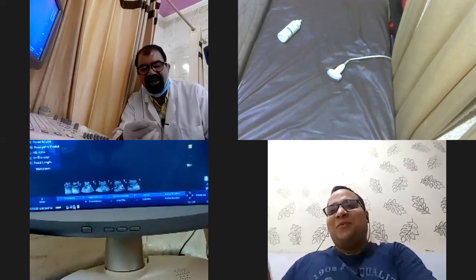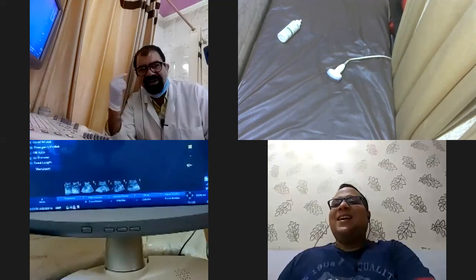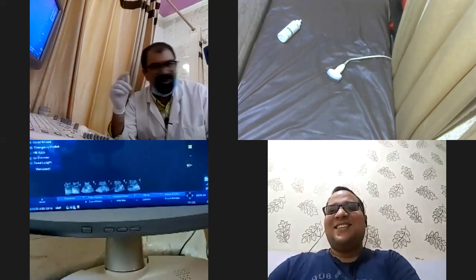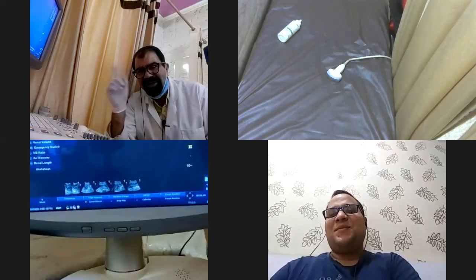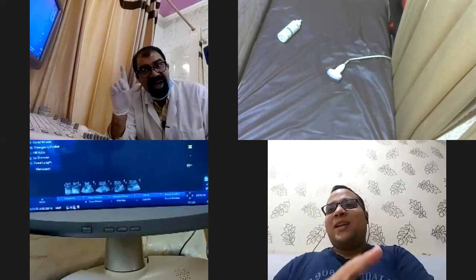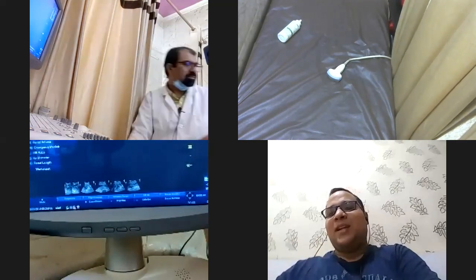Because in the video, you were about to pose me that question. Now, see, I can even smell your mind, what you were about to pose. You were about to pose the question: what is the difference between the pulse repetition frequency and the frequency? They are different, sir. Yes, sir, in the theoretical lecture, they paused at the pulse repetition frequency.